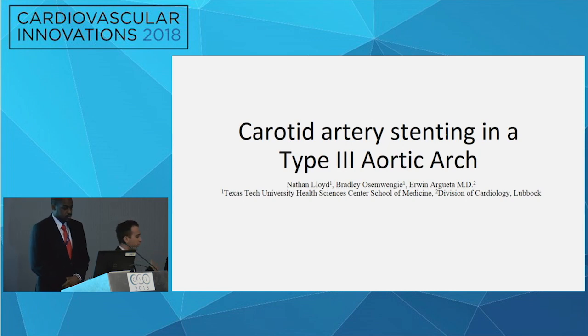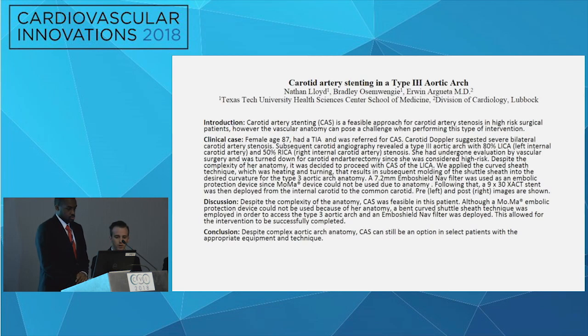We've been doing research with Dr. Ansari, and we're going to present on a case of carotid artery stenting in a type 3 aortic arch. Dr. Argueta was our mentor in putting together this case. So this is our abstract. We'll just move past that.